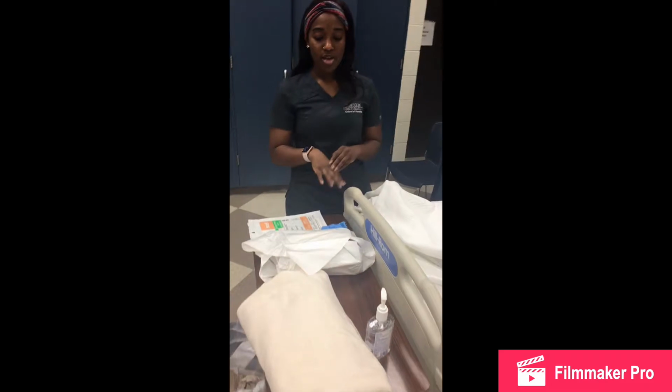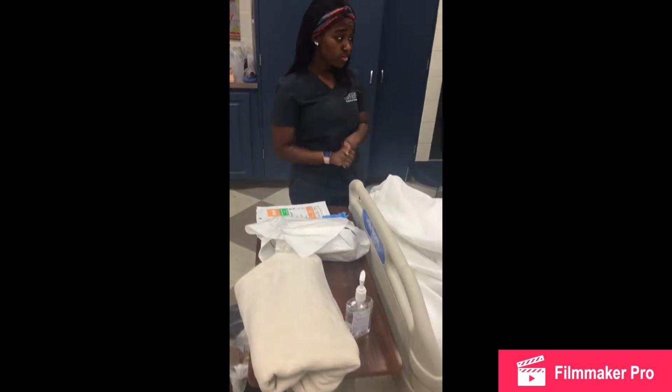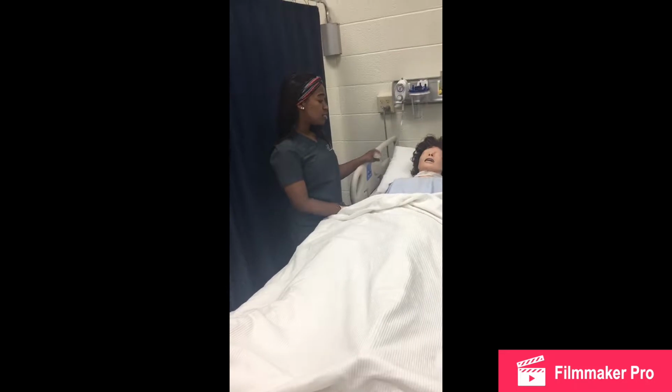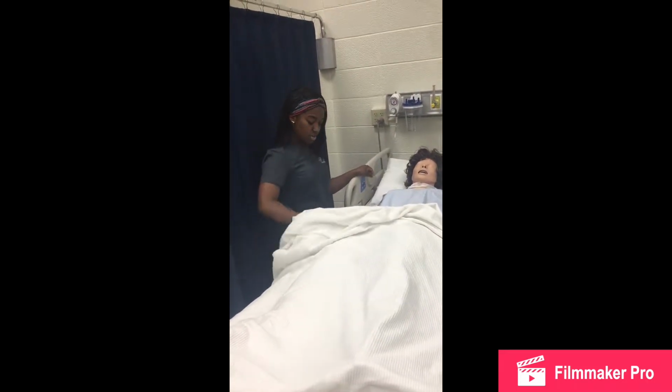Prior to walking into the room, I've already got all of my materials. I'm going to walk in, I've already washed my hands, make privacy for my patient, and then I'm going to introduce myself to my patient. Hi, my name is Naima Lawson. I'm going to be your student nurse today. Can you please state your name and date of birth?